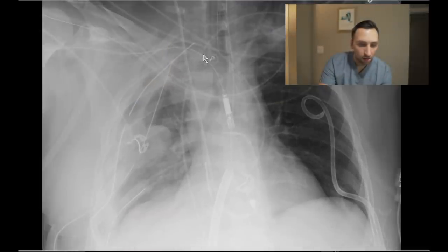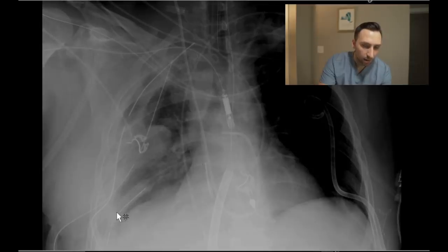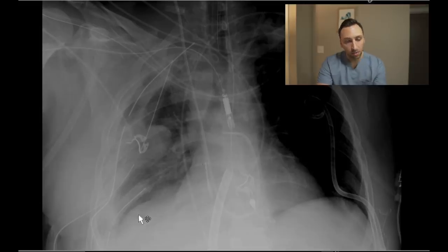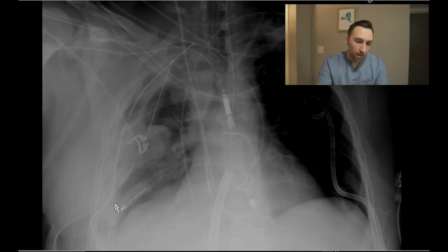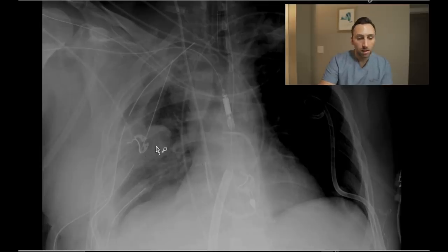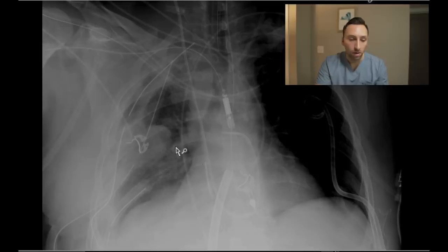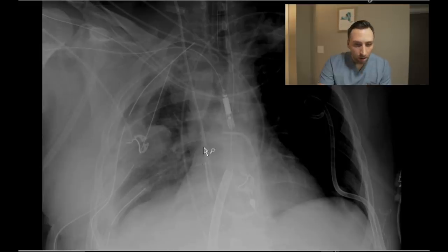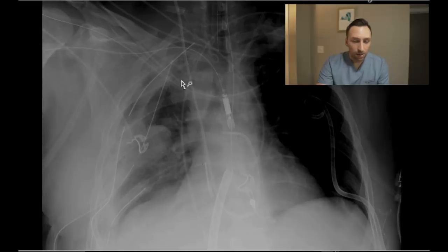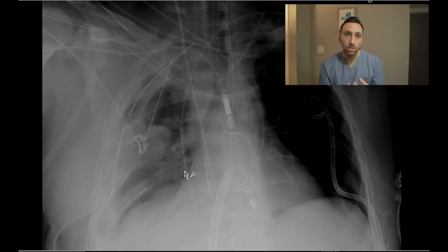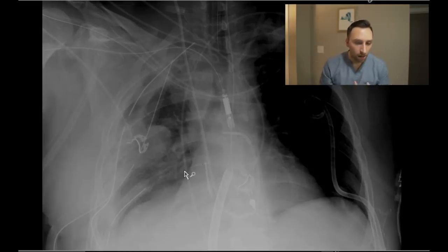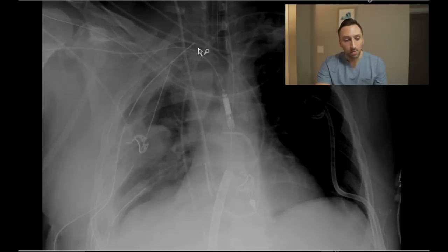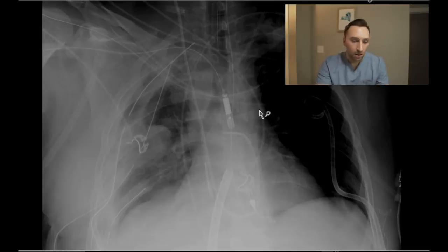The left lung field looks pretty clear honestly — I see no obvious pleural effusion down here. Moving to the right, you can see a nice tracking opacity along the right lateral pleura and into the costophrenic angle, which likely represents a pleural effusion tracking along the pleura. There's also a more focal opacity along the right minor fissure — this could be a loculated portion of fluid or loculated pleural effusion in the fissure, or it could be an underlying mass or infection. There are also scattered diffuse opacities throughout the lung, possibly secondary to pleural fluid making the lung wet, along with a component of atelectasis given the low lung volume. However, underlying infection is also a possibility depending on how the patient is doing clinically.